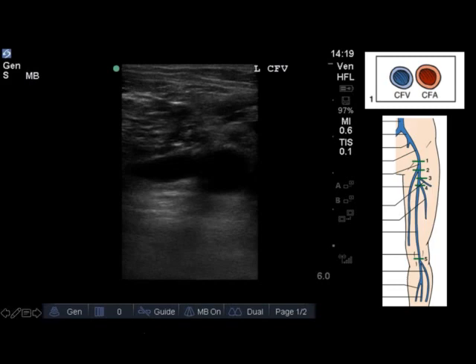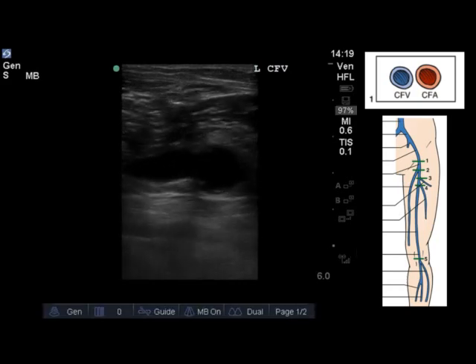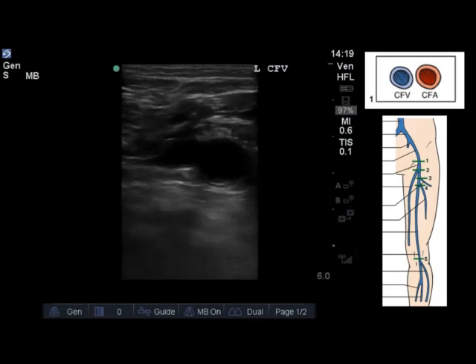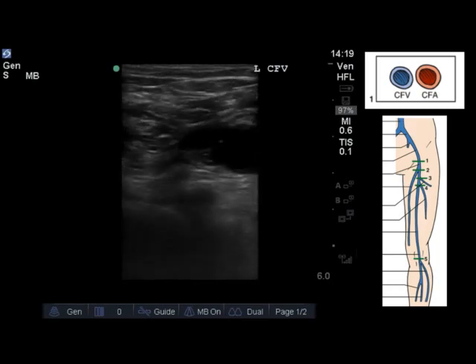Now we're going to move on to a DVT exam that I performed during my time with the POCUS service at Western University in London, Ontario. Here we're starting on the left leg.